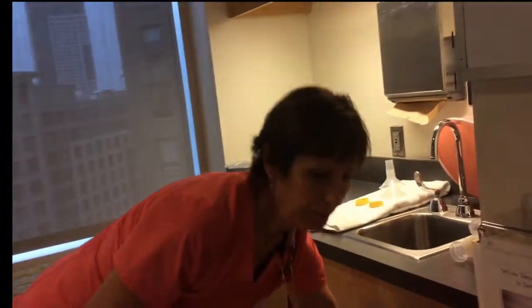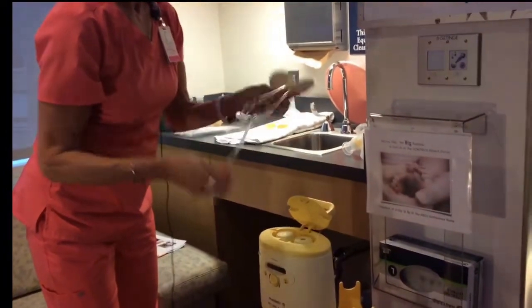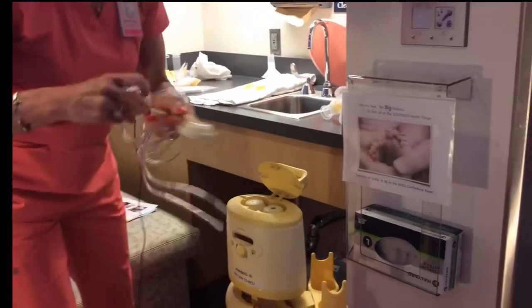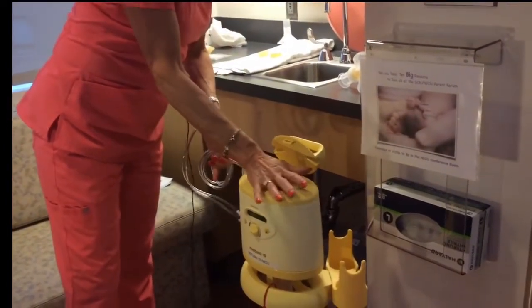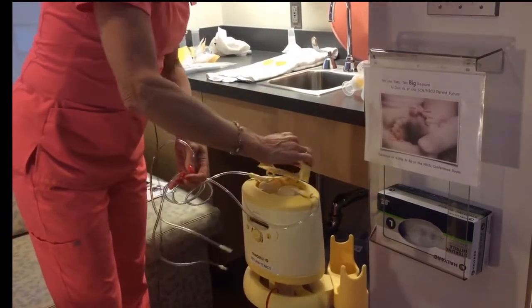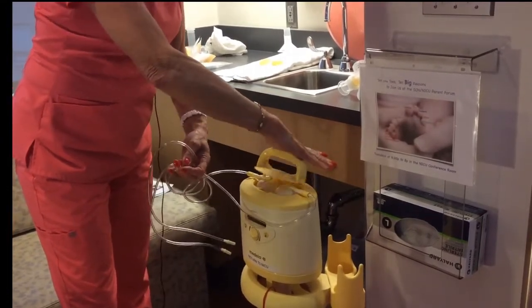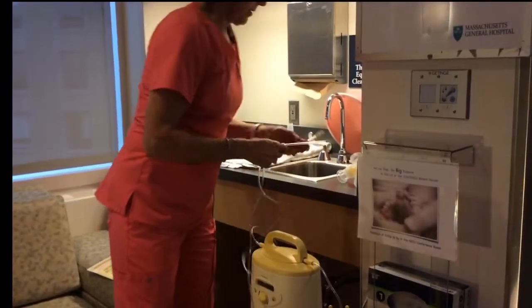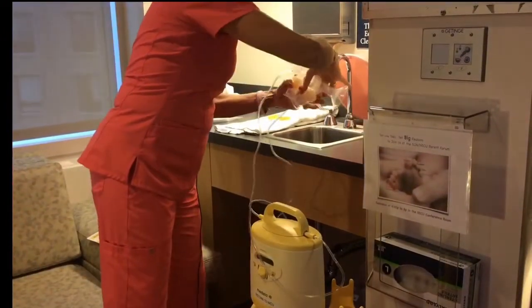Now you're ready to set the pump up. This opens the door. You want to make sure all connections are tight. You're going to put that cap on — I use the palm of my hand to make sure that it snaps in place. Shut the door, because if you turn it on and the door is open, those might pop off. Then put the tubing into the back of the connection.